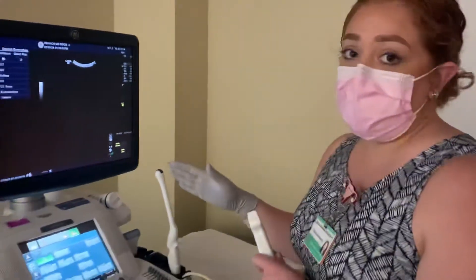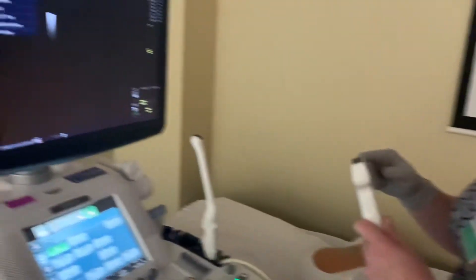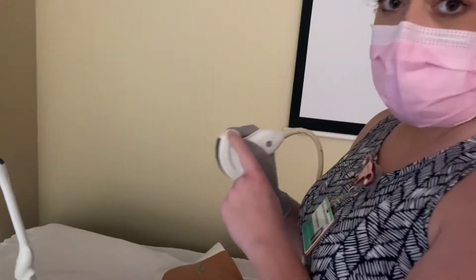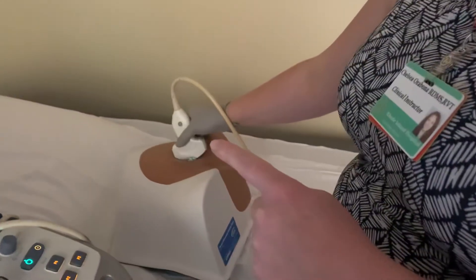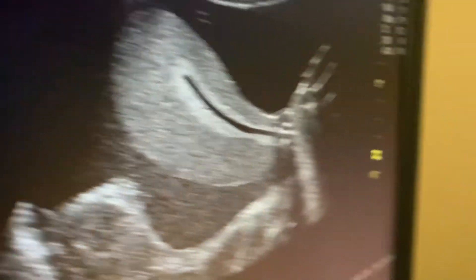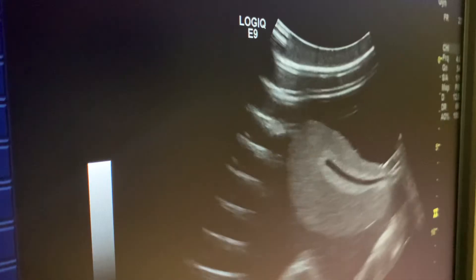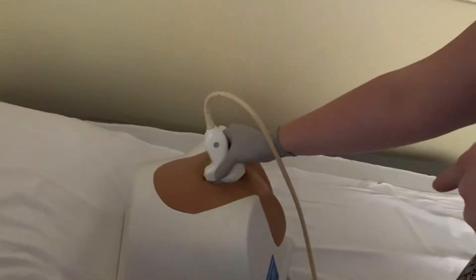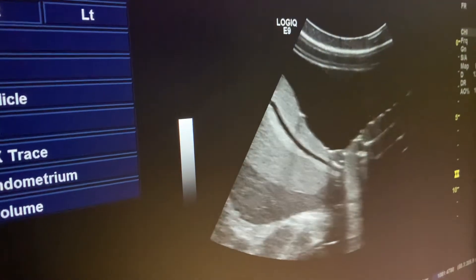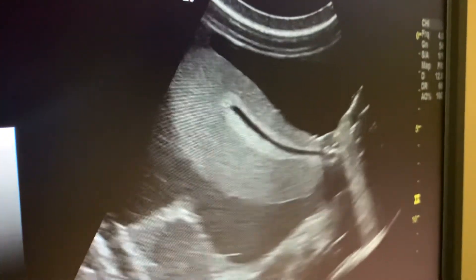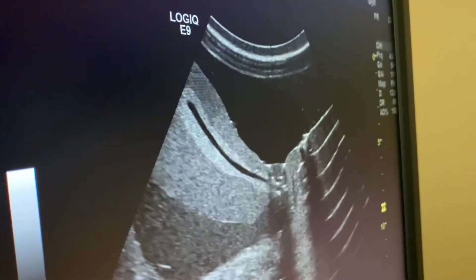Today we're going over transvaginal ultrasounds. I want to do a quick recap on what we're doing with the probe and what's happening on the screen simultaneously. If the probe is in sagittal with the notch up and we're scanning the pelvis, when I move the probe up we're getting more towards the fundus, and if I angle down we're looking at the cervix. The term for this is 'seesaw' — seesawing the probe upwards towards the fundus and down towards the cervix.